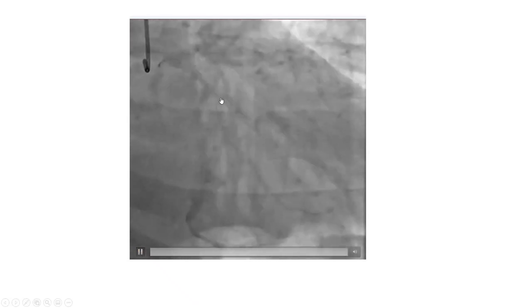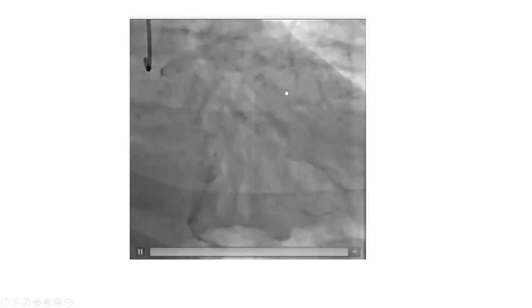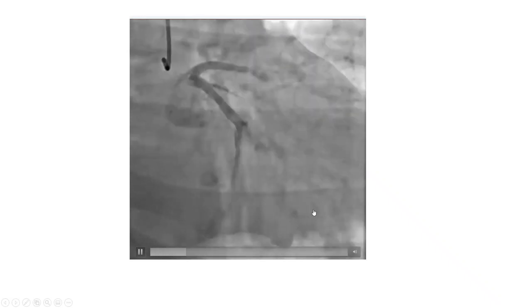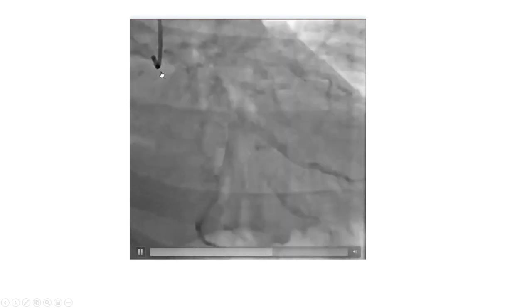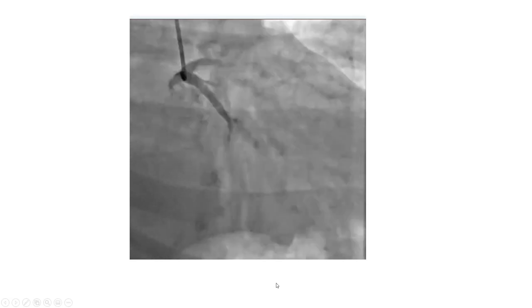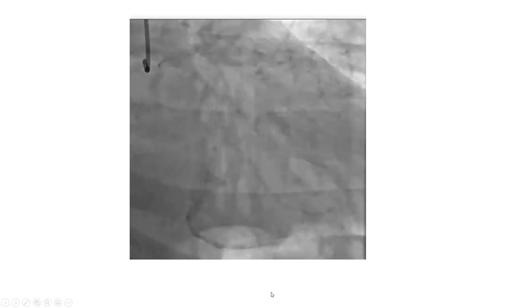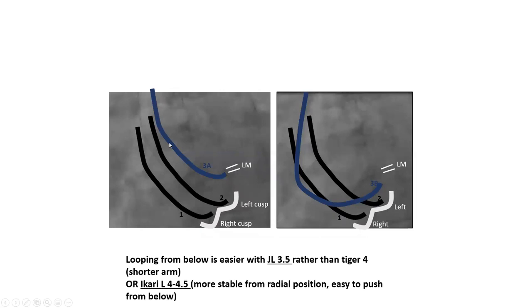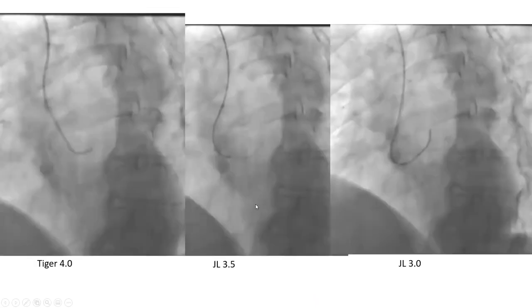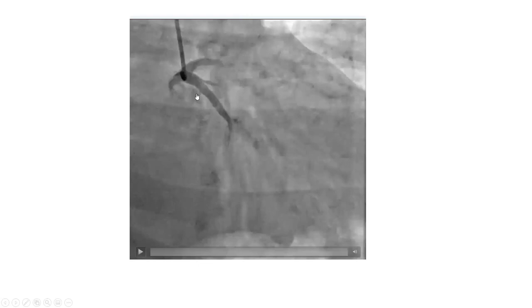Here's a common situation: we engaged successfully with a Tiger, but the catheter keeps popping out with injection. You don't want a coronary angiogram with a catheter that keeps popping out. One reflex is: engage from below. Engaging from below in a radial axis is the way to get stable catheter and stable pictures. One option is to change strategy — try to engage from below with the same catheter. If it doesn't work, change catheters.